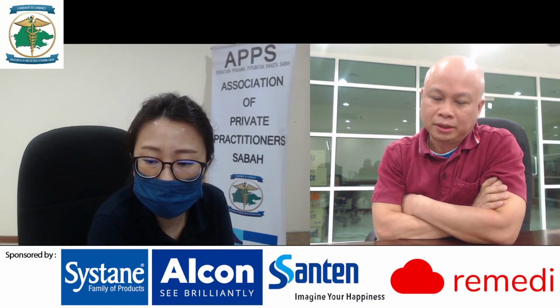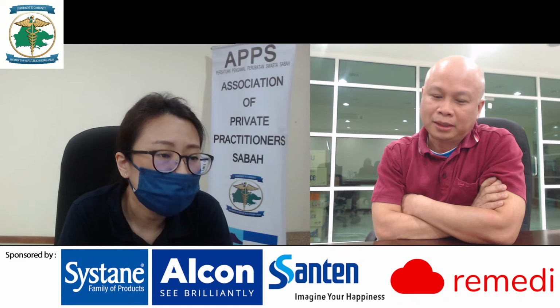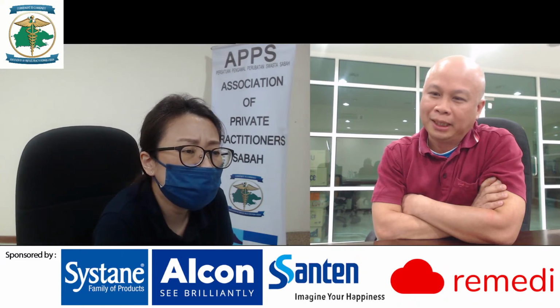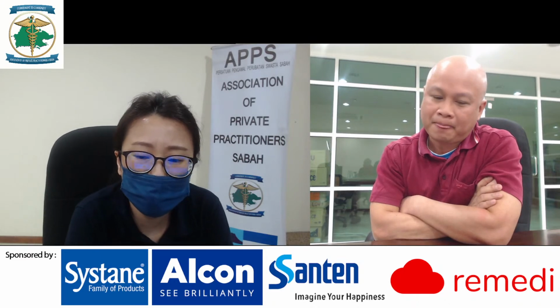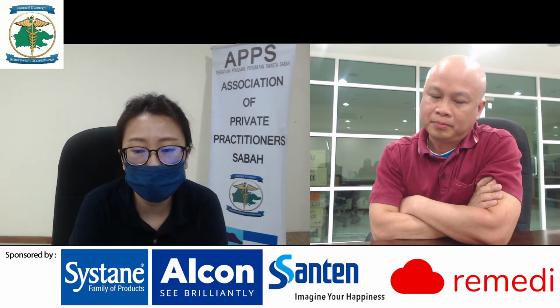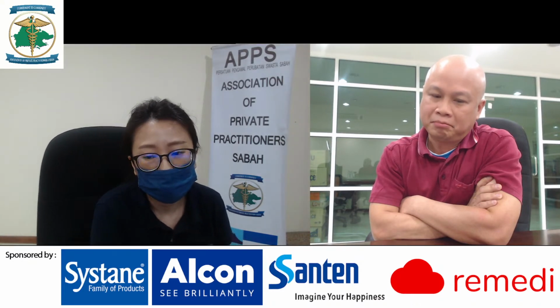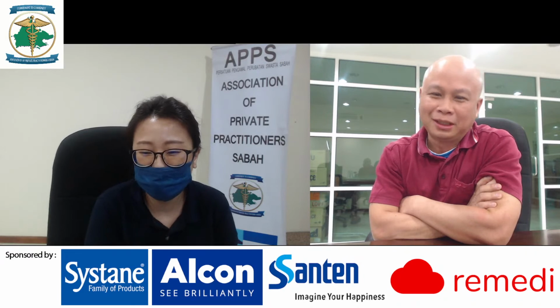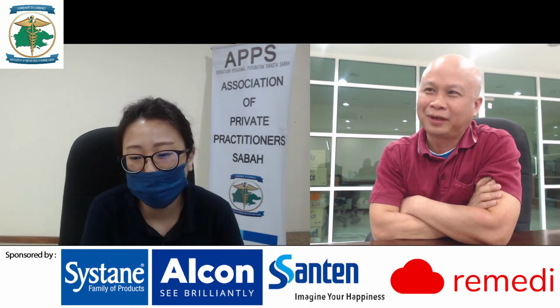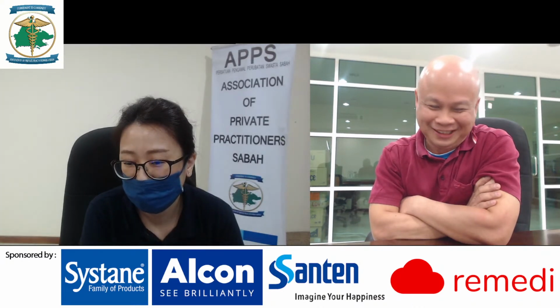I think what Dr. Lau is asking is how the same procedure can be used to treat different conditions of the eye. From my experience, I think it's the way they actually ablate the cornea. Correct me if I'm wrong. For short-sightedness, usually we flatten your central cornea, as opposed to long-sightedness, which is hyperopic LASIK, where we steepen your peripheral cornea. Basically, how you cut your cornea to refract, how to reshape your cornea. Exactly. I hope that answers his question.